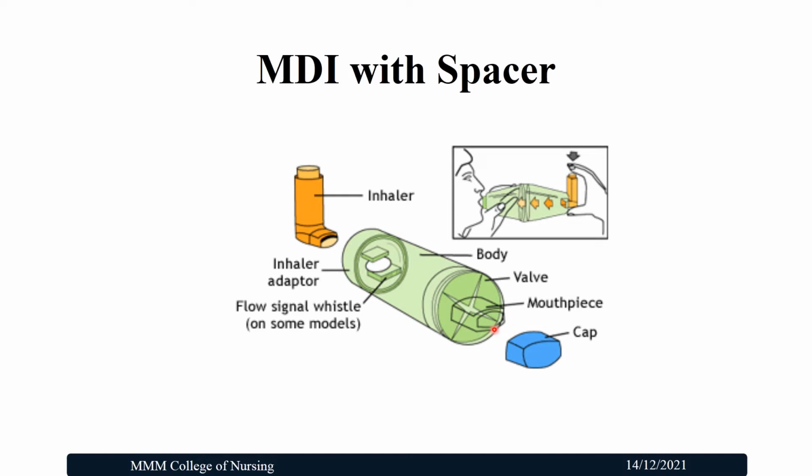When the patient is using it, the chamber will have some air within it. When the medicine is administered inside, the patient can breathe several times, taking it as a diluted form of aerosol. So it will be more effective when we compare it with the direct use of the metered dose inhaler.